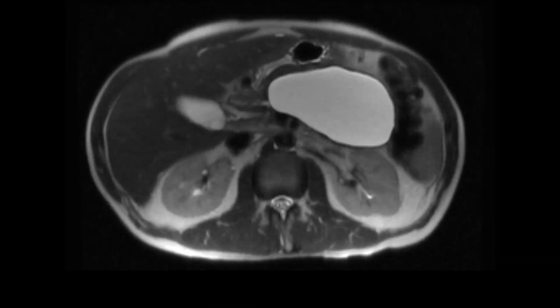Now, if we have a fluid collection in the pancreas where we had necrotizing pancreatitis and more than four weeks have passed, we call this walled-off pancreatic necrosis — walled-off necrosis. That's what we have here.